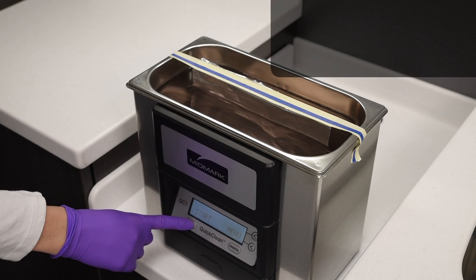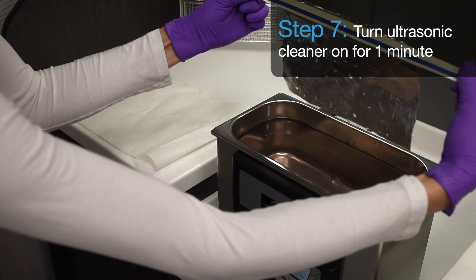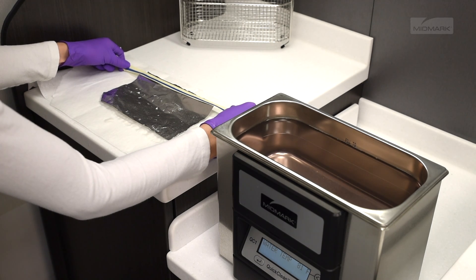Step 7. Turn the ultrasonic cleaner on for one minute. Remove the foil sample, allowing the excess cleaning solution to drain off the foil. Allow the sample to air dry, being careful not to wrinkle the foil.